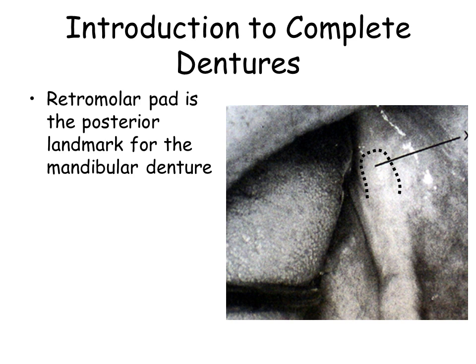The retromolar pad is a triangular soft pad at the distal end of the ridge. The muscle attachments in this area make it resistant to resorption. The denture base extends 2/3 up the retromolar pad, about to the area of the black line. This important landmark signifies the terminal end of the denture, as well as defining the occlusal plane of the posterior area.